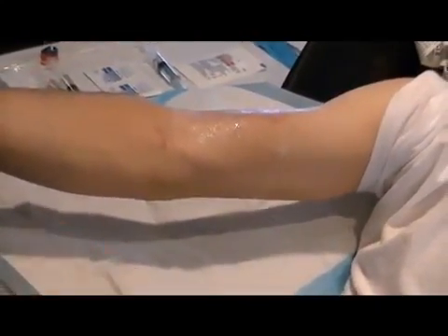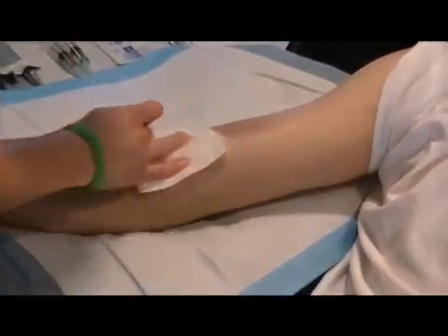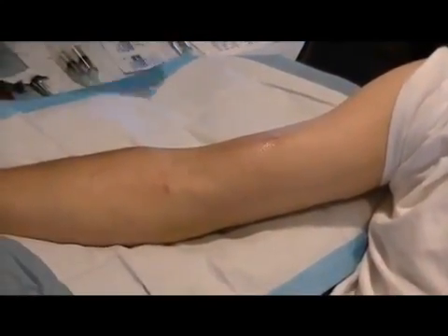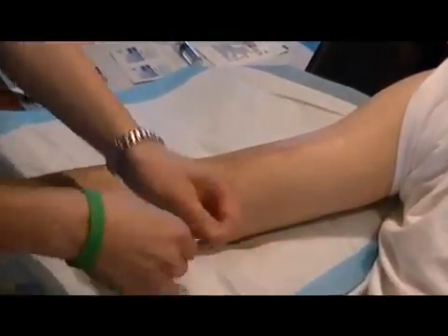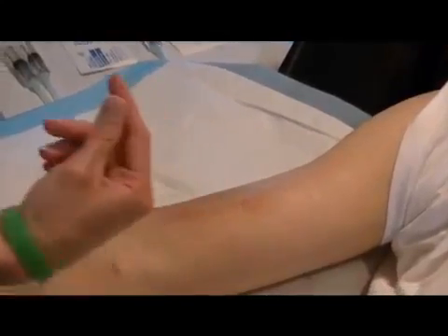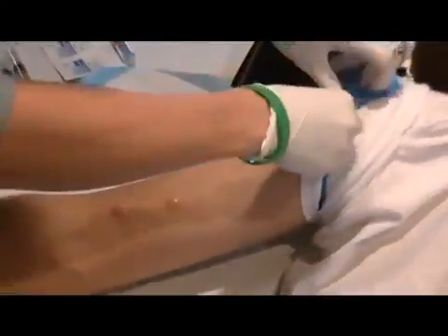And we'll have some cleaning stuff here that you'll clean his arm off. And then you use alcohol. Clean it. Then we use the buttonhole technique where you use the same 2 holes every time. So then you have to take tweezers and pick off the scabs before you actually put the needles in. Then we're going to get ready to stick.